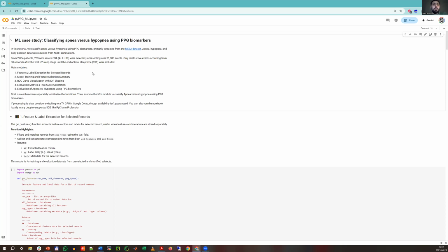In our original dataset, we had more than 2,000 patients, and we selected 263 with obstructive sleep apnea, which includes more than 31,000 obstructive sleep apnea events.